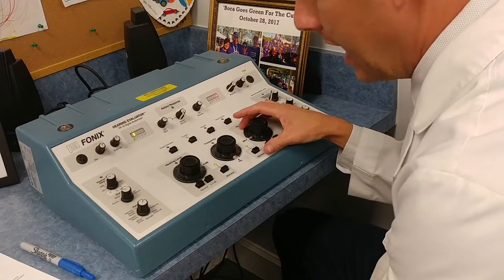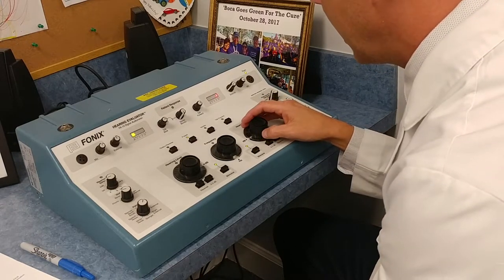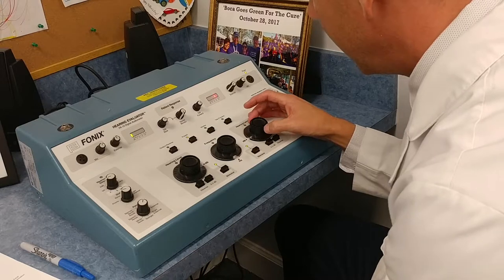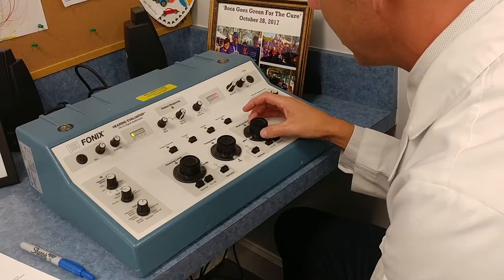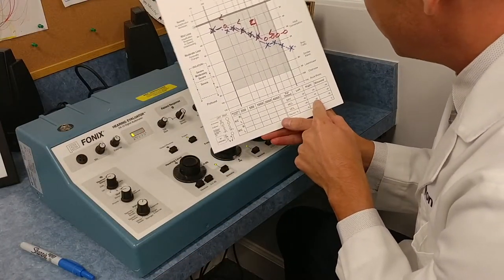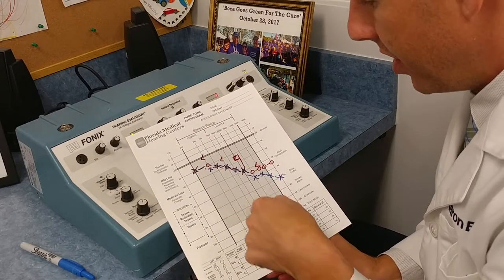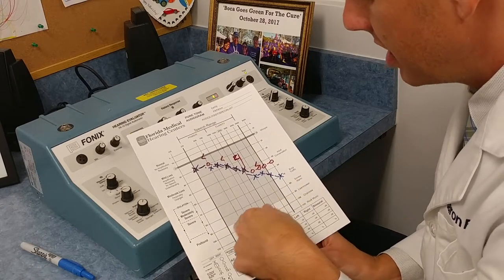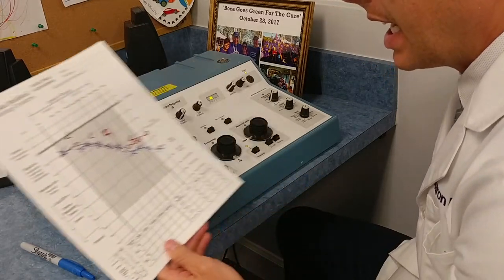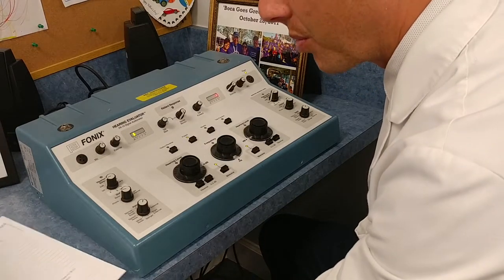I'll ask the patient: if I were the television, would you turn me up, turn me down, or is this comfortable? Once they converse with me, I use up 5/down 10 to find their MCL. From there I'll let them know I'm finding their uncomfortable listening level — again, this ensures the hearing aid never amplifies anything uncomfortably — and I add 5 decibels to MCL until I find that spot. You can also do UCL discretely on every pure tone frequency to get better first-fit information to put into NOAH.